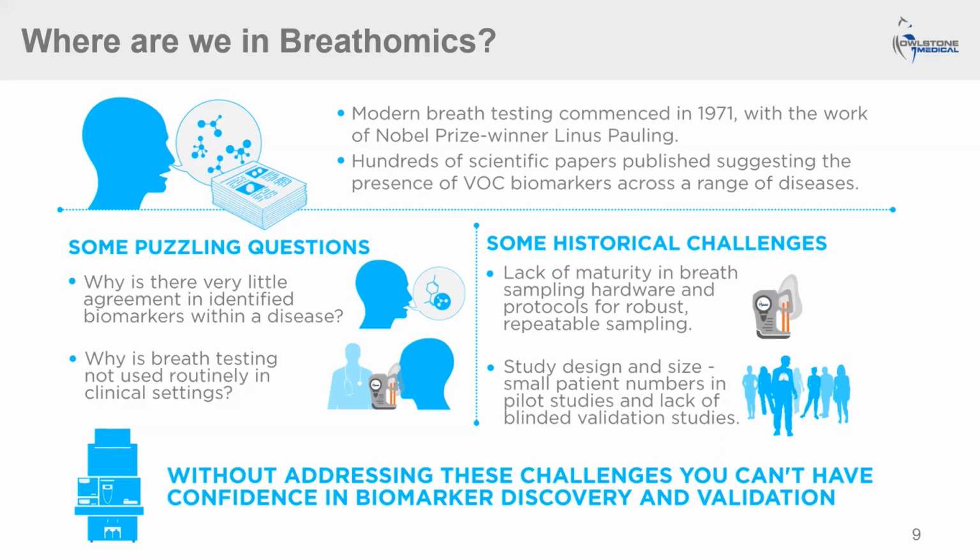Another thing that becomes clear is that there was no standardization of breath collection and analysis. These homebrew methods really lack the hardware and protocols necessary for robust, repeatable breath sampling that is necessary for confident biomarker discovery and validation.